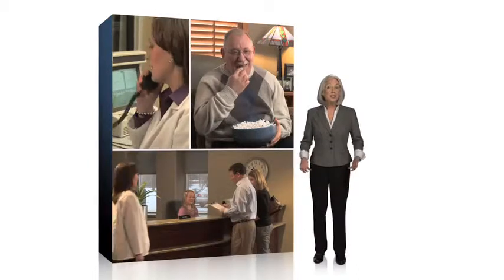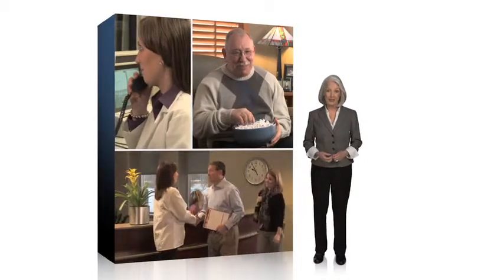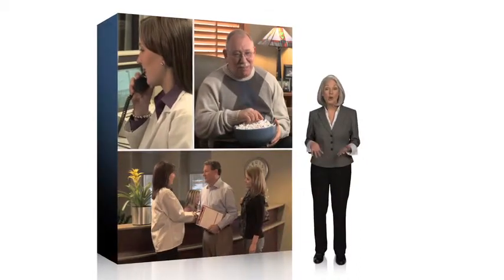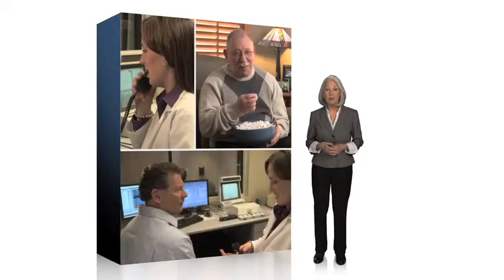Congratulations on your new hearing aid. As you continue along your journey, we're here to help every step of the way. The first thing you need to know is you're not alone. In-office visits and calls to your hearing professional are all part of your service package.